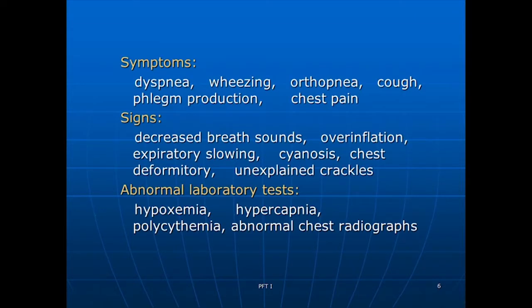So basically there are three indications for use of pulmonary function tests. One is diagnostic, so this is for diagnostic purposes. Patients often come to the physician and they have various signs and symptoms. One of the most common symptoms that a patient has is going to be dyspnea.